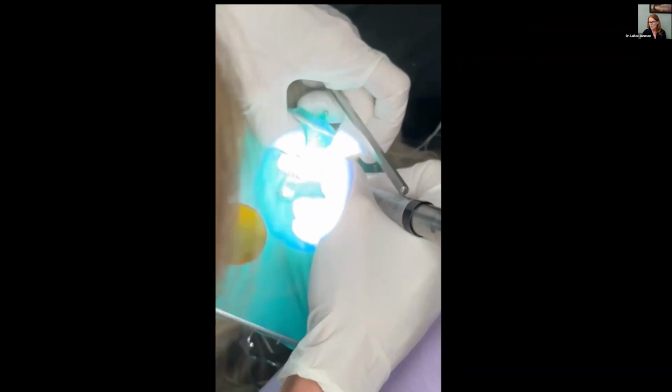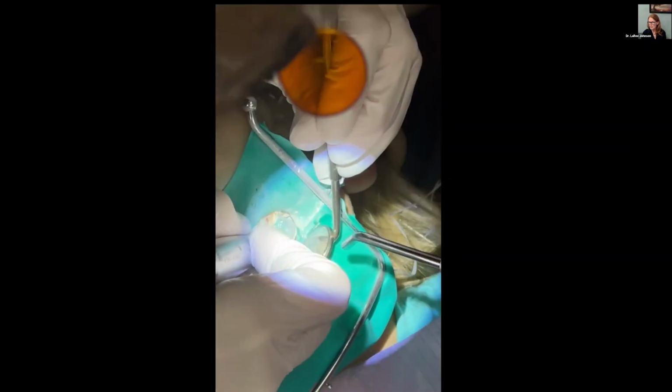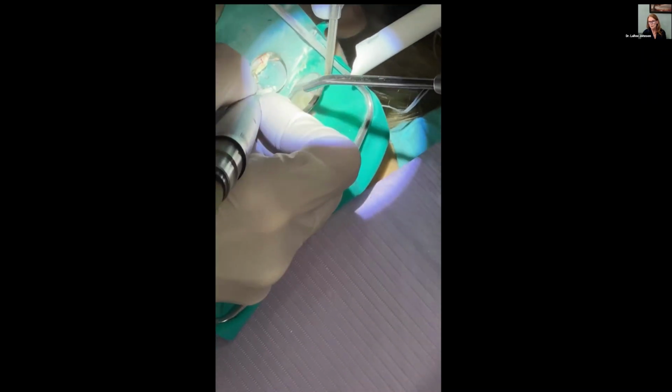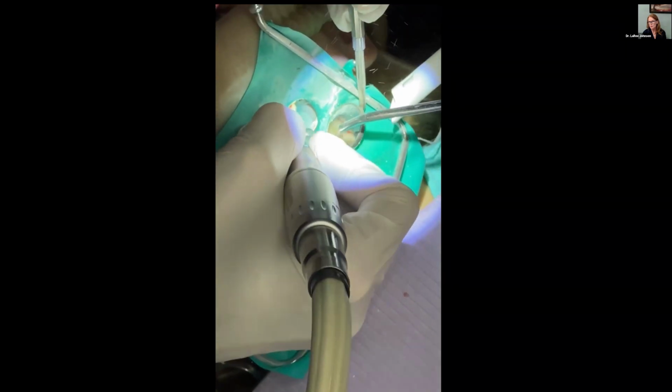And we're just going to start prepping, getting things along. Yes, I don't always, but oftentimes cut dry most of the time. Keep the tooth cool, burr cool, mirror clean. Dental assistants are trained. We're doing everything. She's doing really well. Slow speed, doing the caries removal.